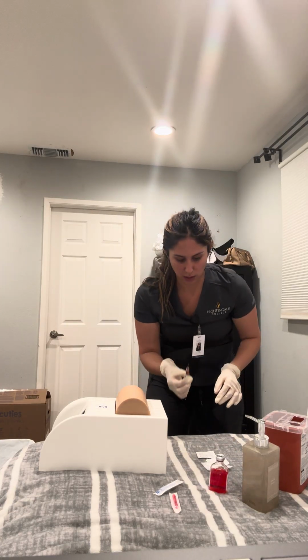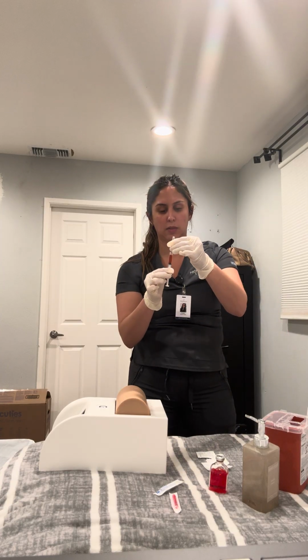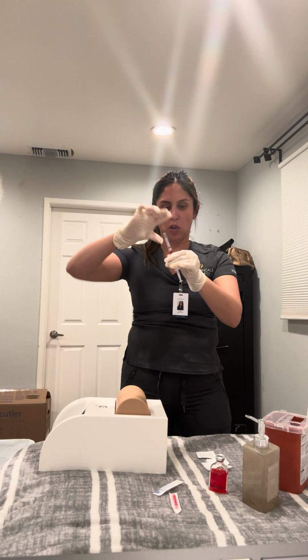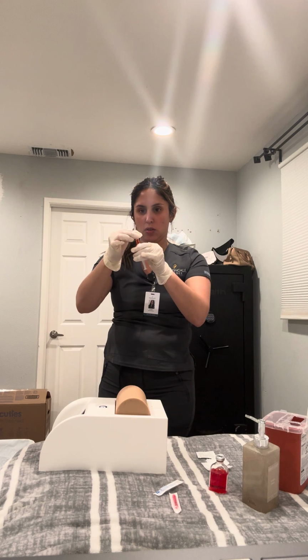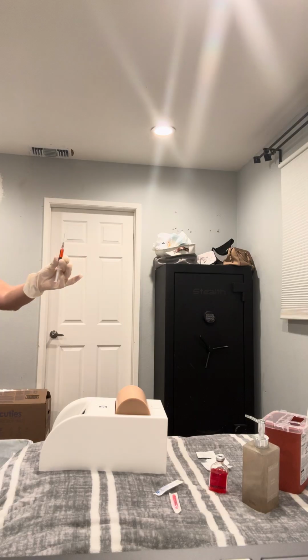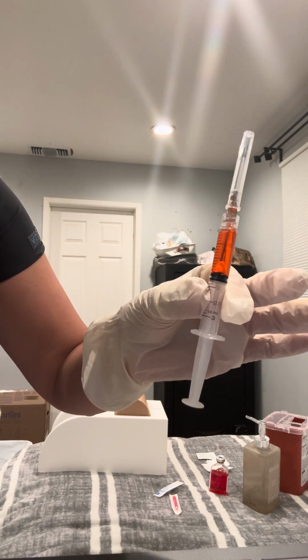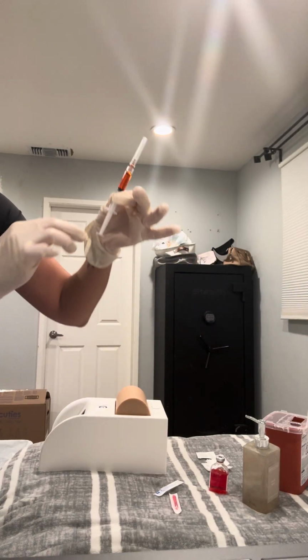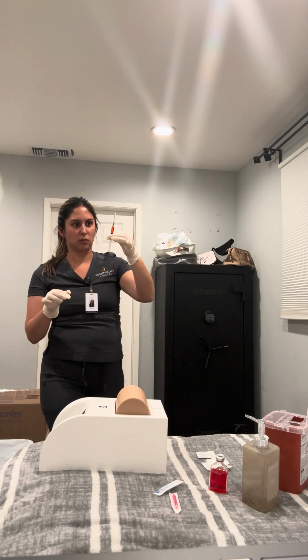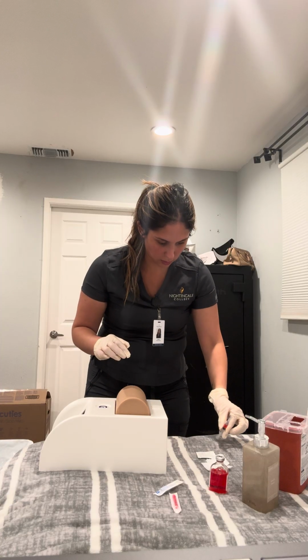And what we're going to do is slowly draw up the medication. Just like that, okay? Just to make sure, it's showing 1.5 mL. Perfect. Okay, so now we're going to put our needle down.